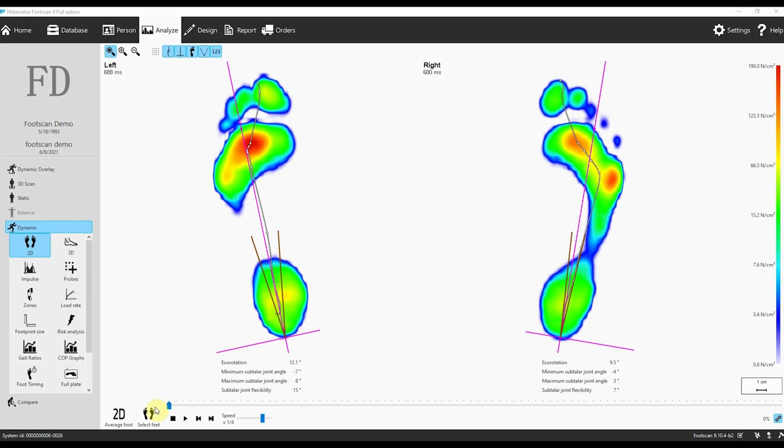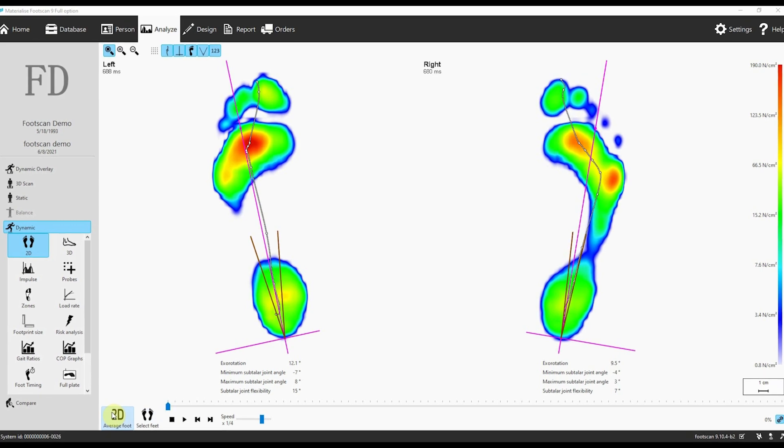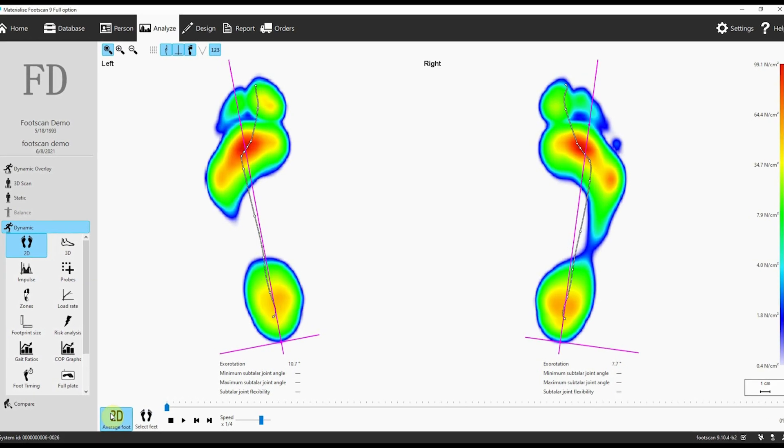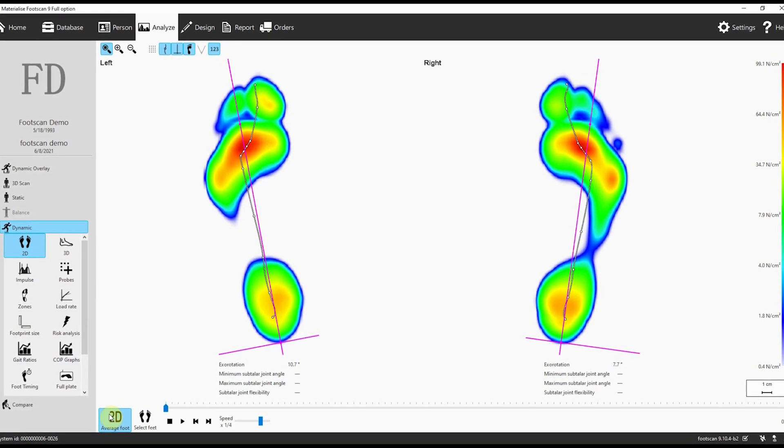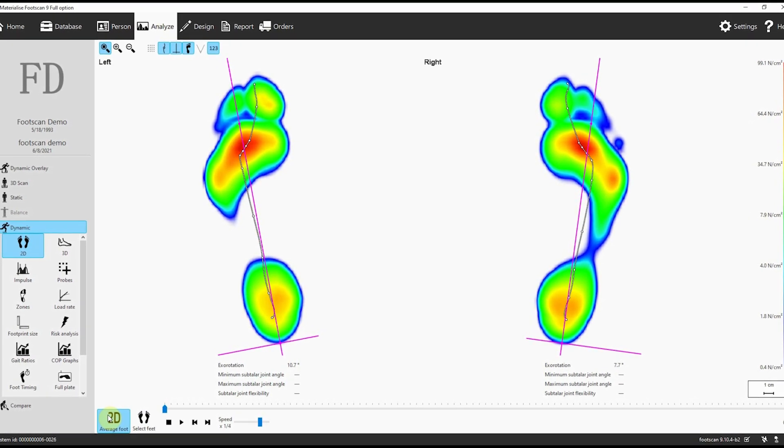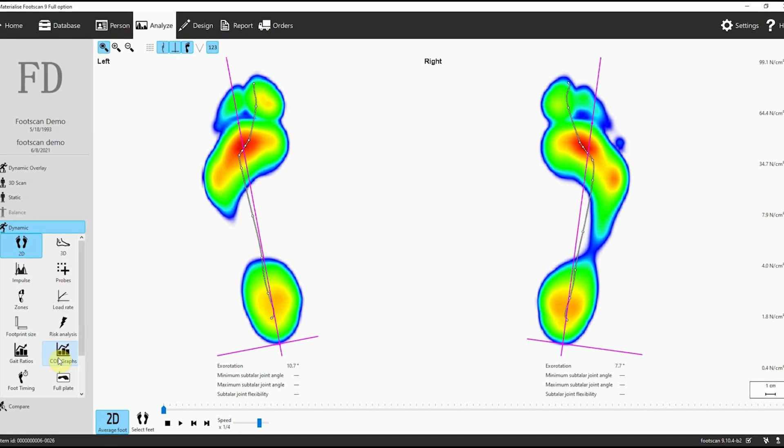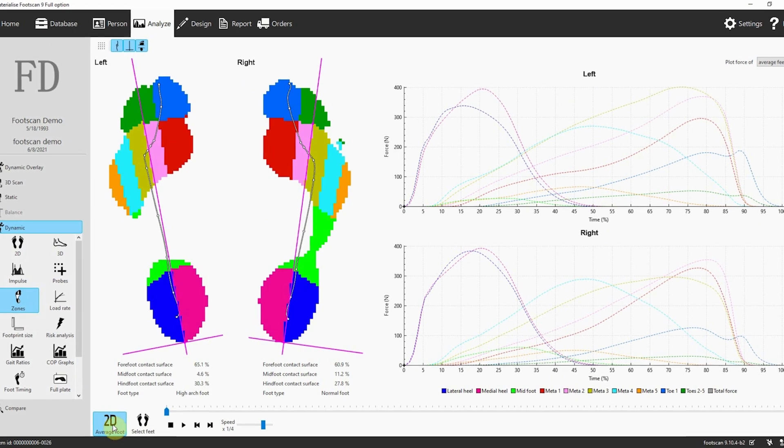Understanding patient movement is crucial. That's why we've added a new analysis tool that displays the average roll-off of your patient's gait, giving you deeper insights into their needs.